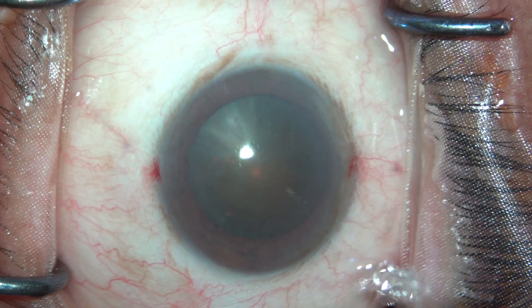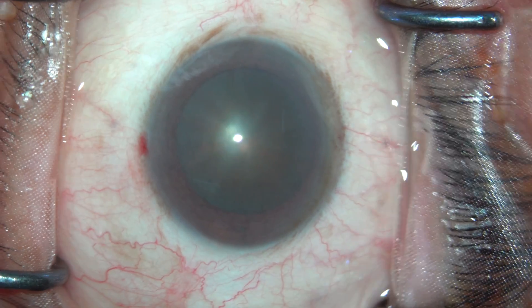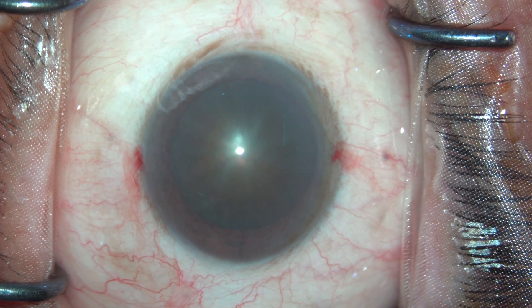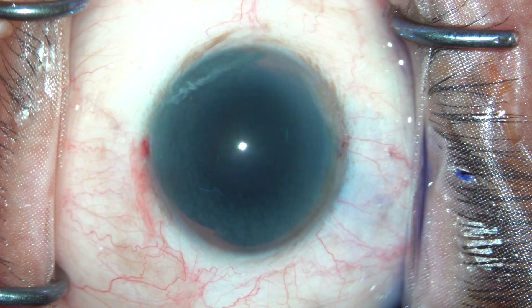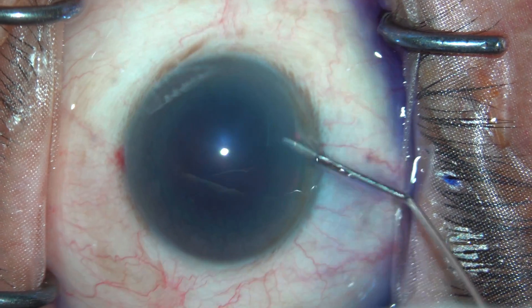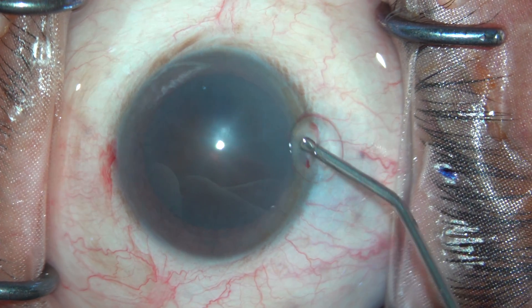These are angled MVRs and I always prefer them in my surgeries. This is using intracameral mydriatic to dilate the pupil and also give an anesthetic effect because it has lidocaine as well. This is followed by staining the anterior capsule with trypan blue. You can also notice the crocodile shagreen that is seen in the periphery of the cornea.